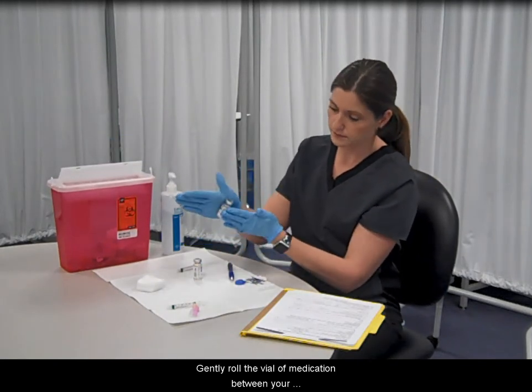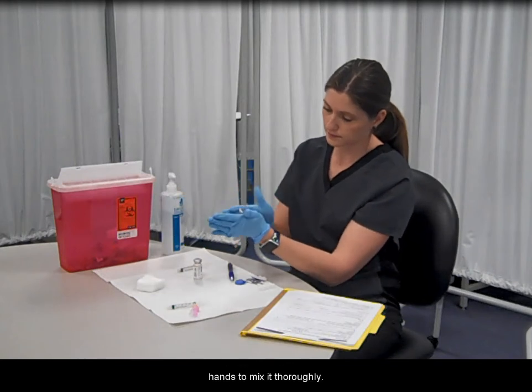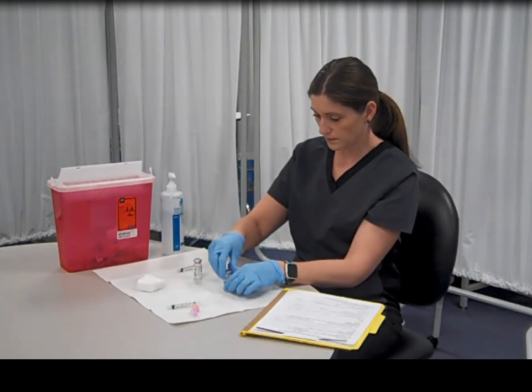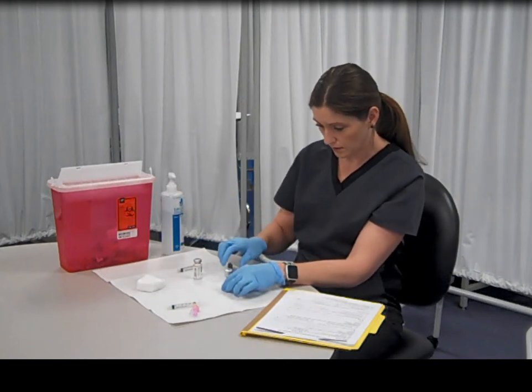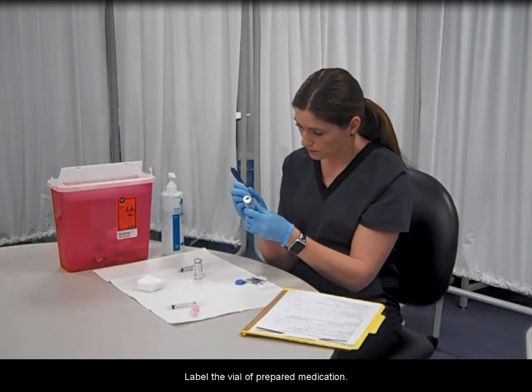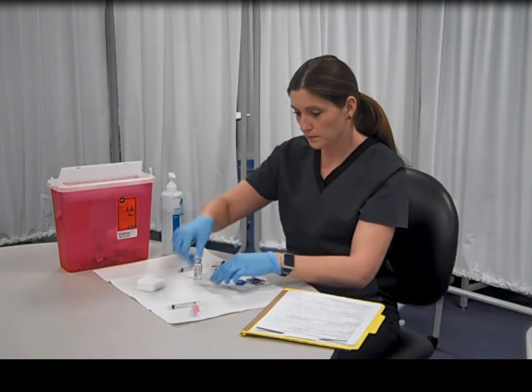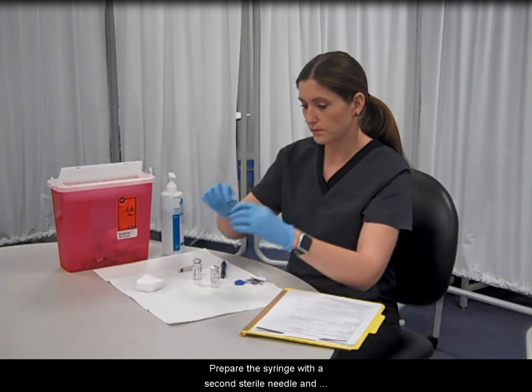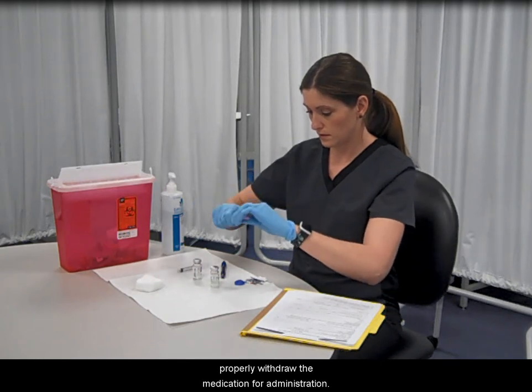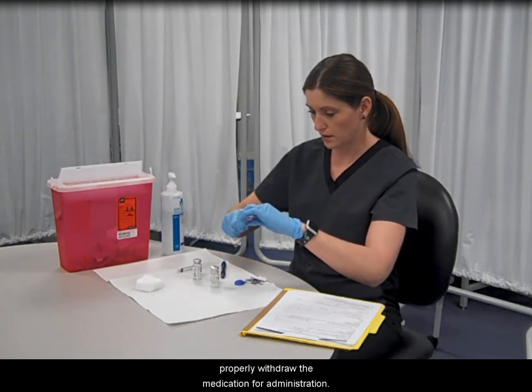Gently roll the vial of medication between your hands to mix it thoroughly. Label the vial of prepared medication. Prepare the syringe with a second sterile needle and properly withdraw the medication for administration.